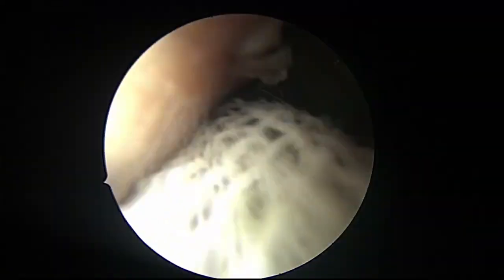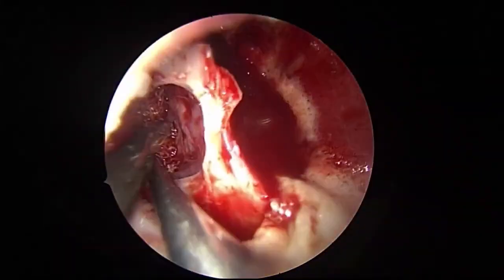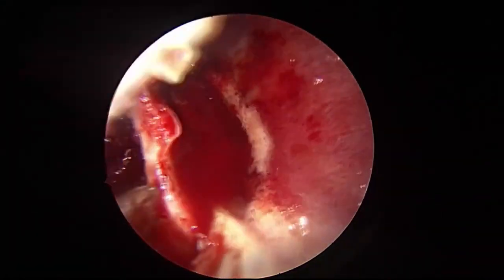By pushing the ribbon gauze, this will mobilize the wall as well as decongest. See that? This is all the lateral wall which is pushed from here.